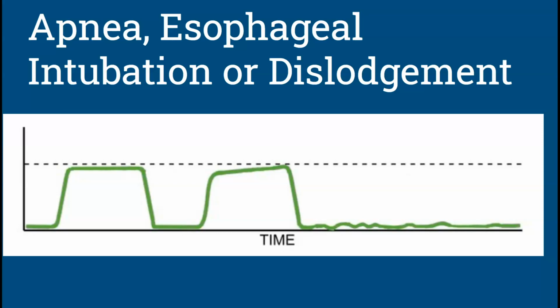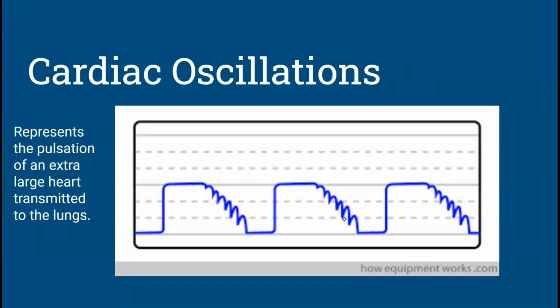Because you're not going to have any oxygen in or oxygen out. This also can give you a good idea if the tube is dislodged or if you're in the esophagus, because the esophagus might give you a very low reading based on stomach acid. But if you have a really nice waveform and then all of a sudden you have a sad asystolic squiggle, you have most likely either stopped ventilating your patient or the tube is dislodged and you should recheck it.